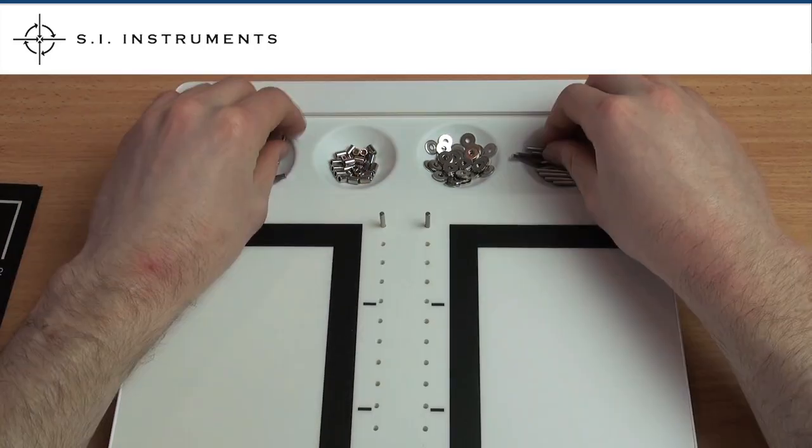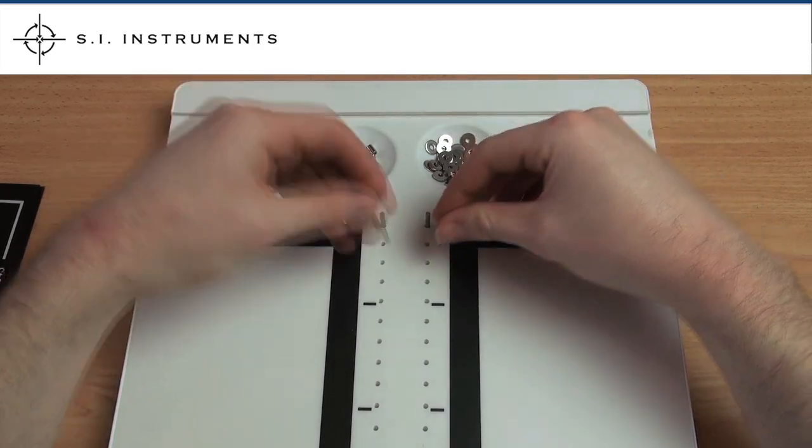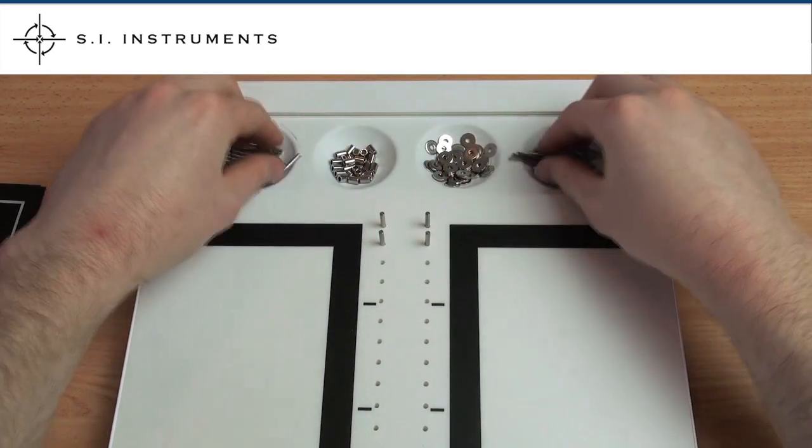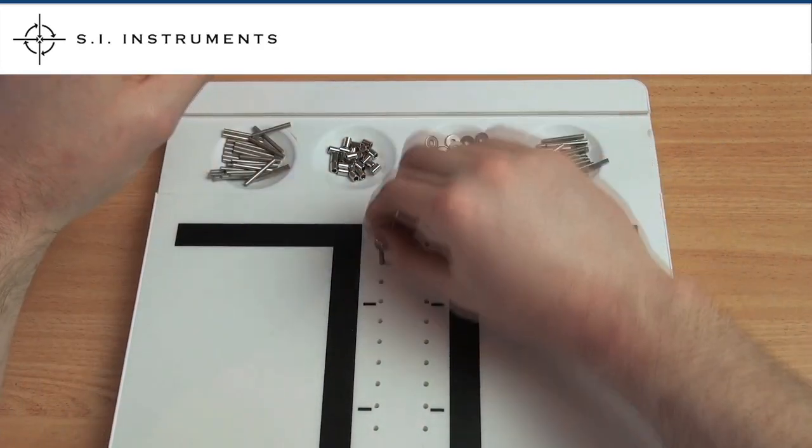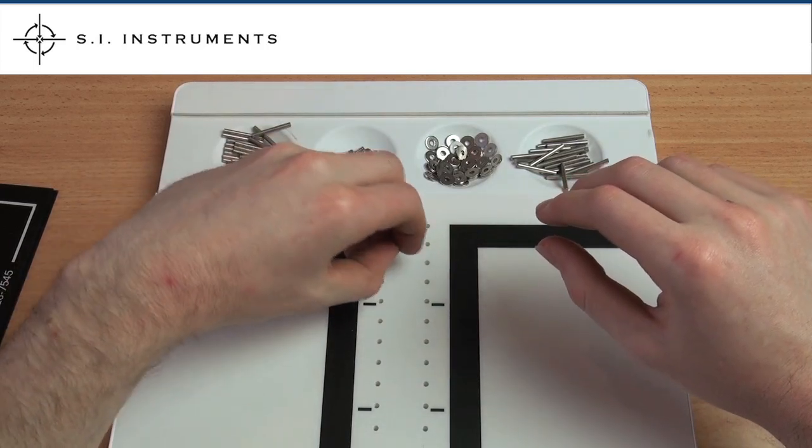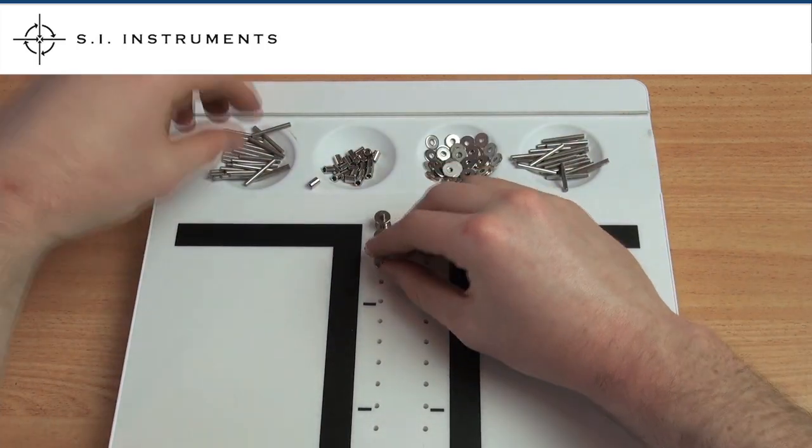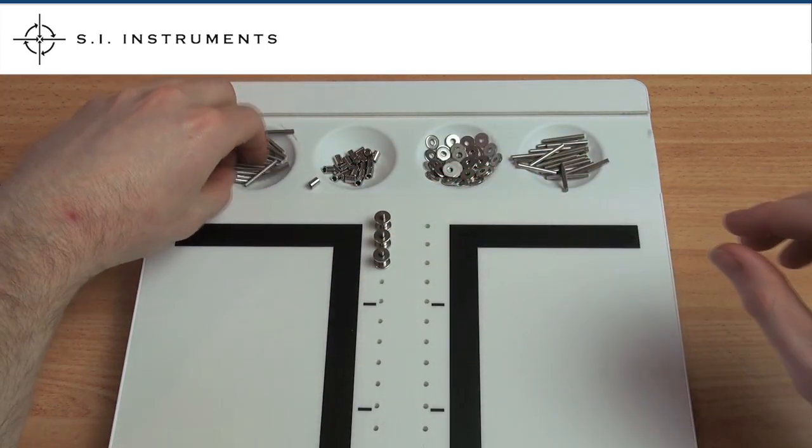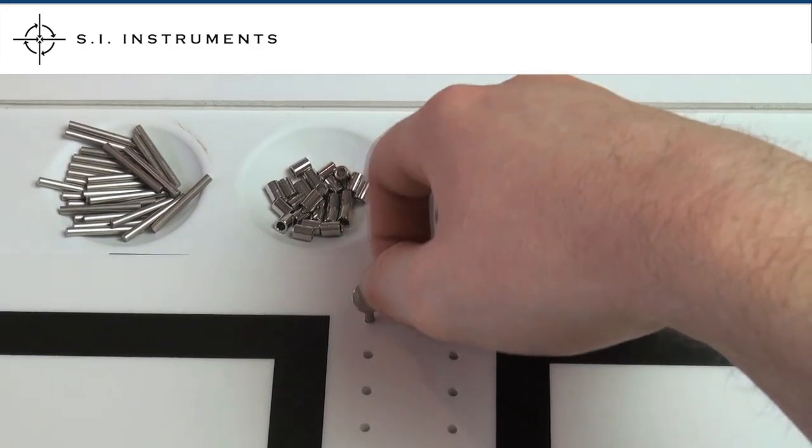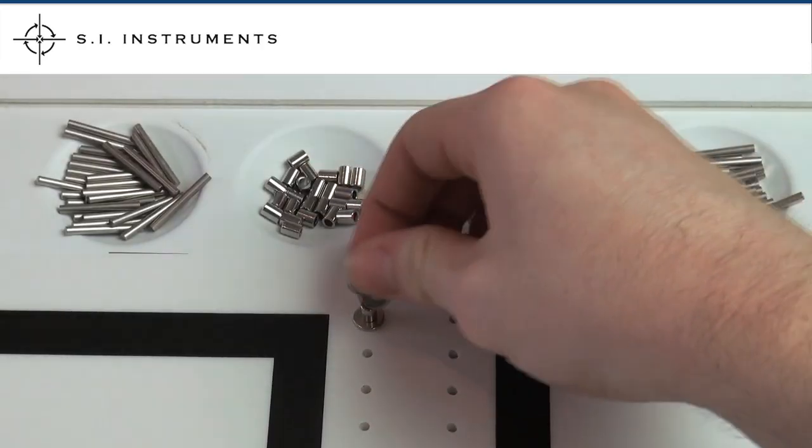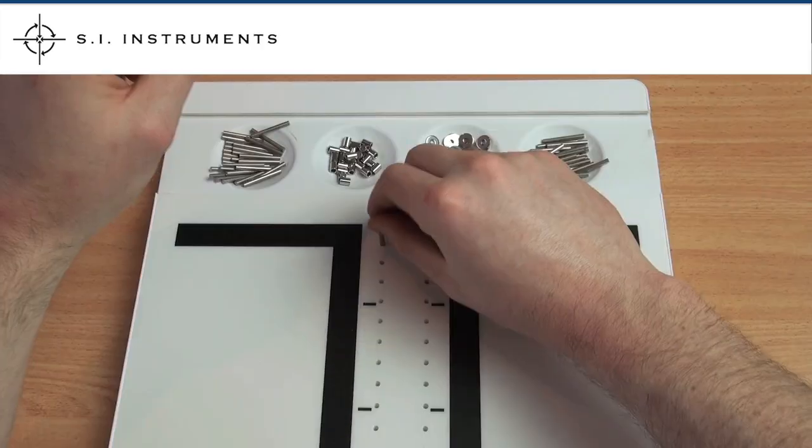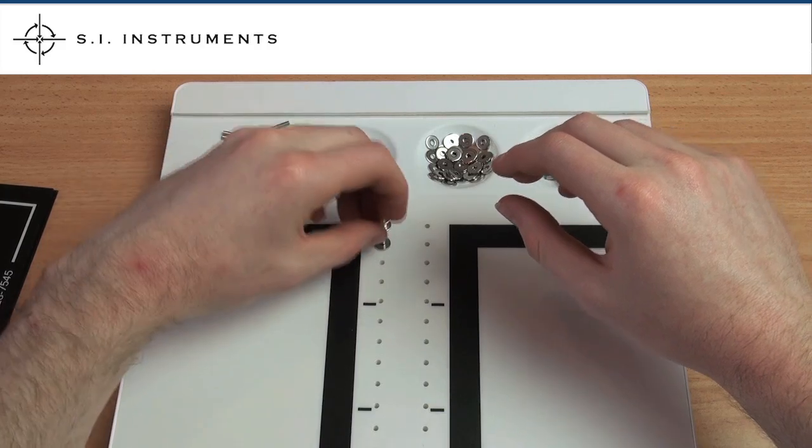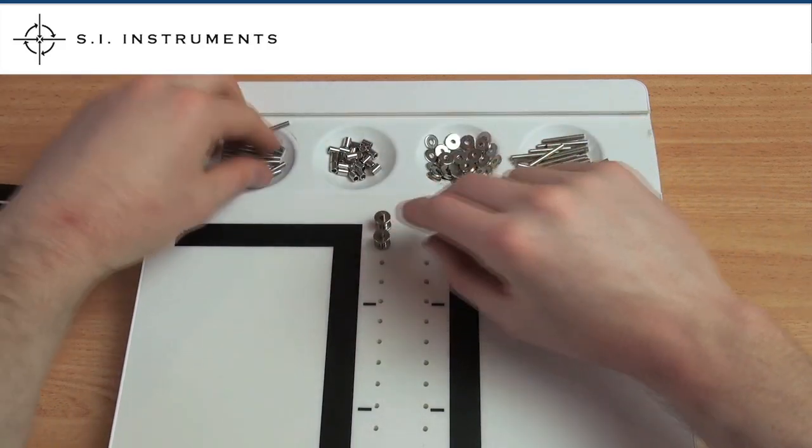Both hands then are used together to fill both rows top to bottom. In the fourth subtest, the subject uses both hands alternately to construct assemblies, which consist of a pin, a washer, a collar and another washer. The subject must complete as many assemblies as possible within 60 seconds.